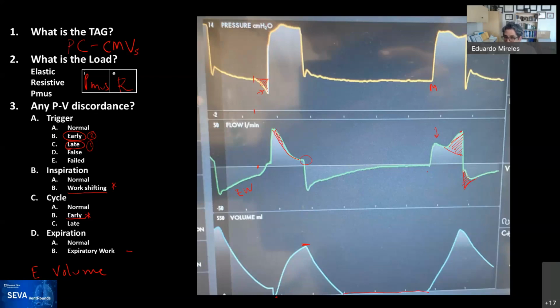We lost it from the scale. It's gone. That probably happened because the patient had air trapped from these two breaths that are here, one after the other, and then the patient was able to exhale, and then got another breath with effort on top of it. So just a manifestation of where we are.